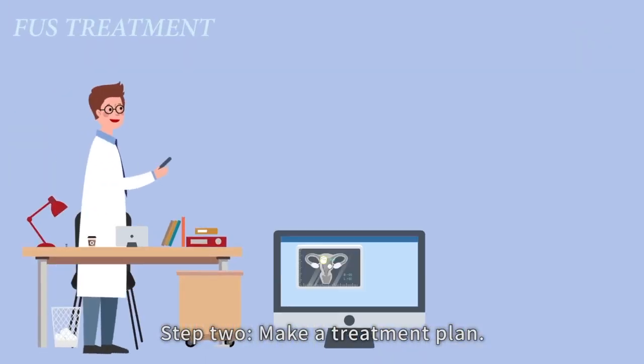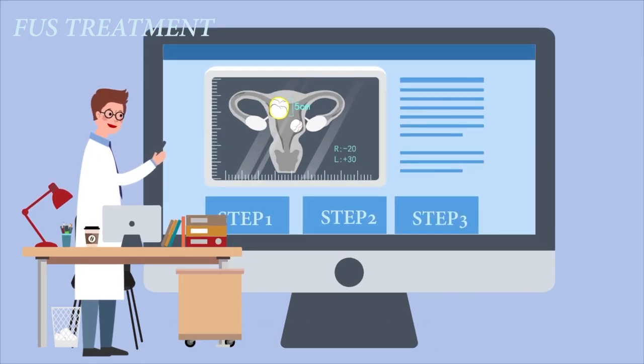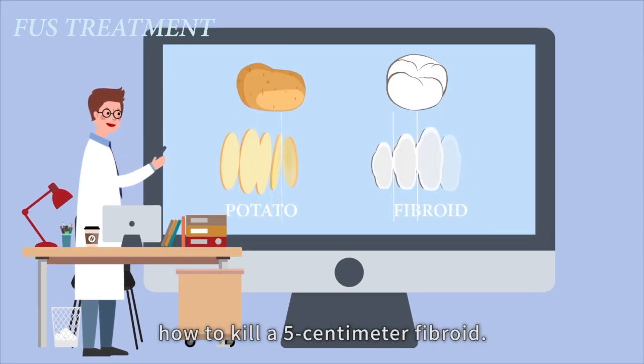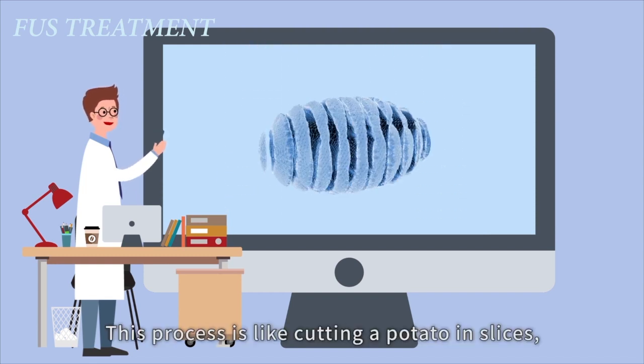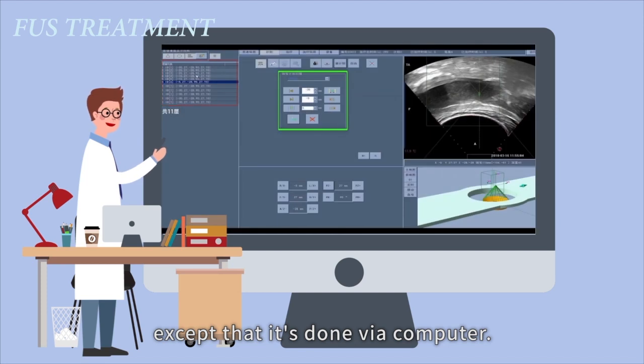Step two: make a treatment plan. A computer will help us plan out how to kill a five centimetre fibroid. This process is like cutting a potato in slices, except that it's done via a computer.